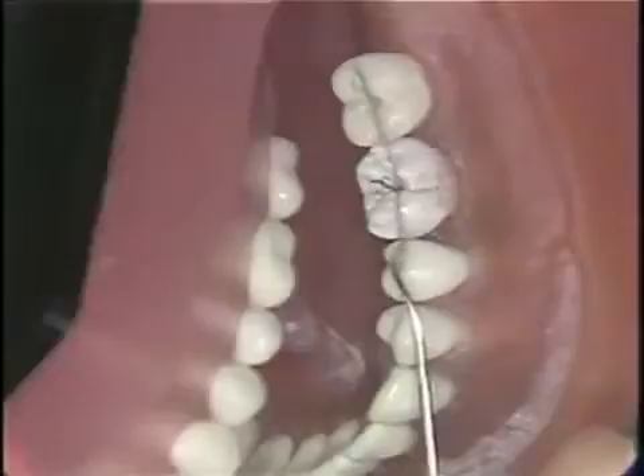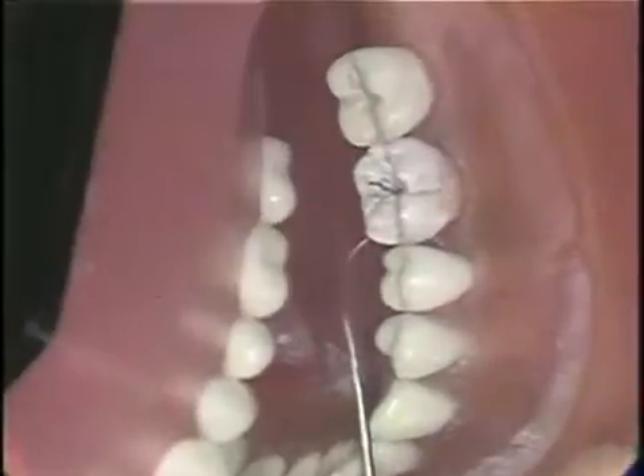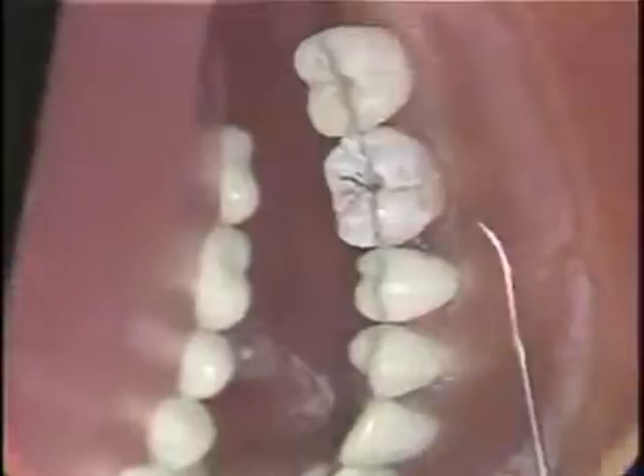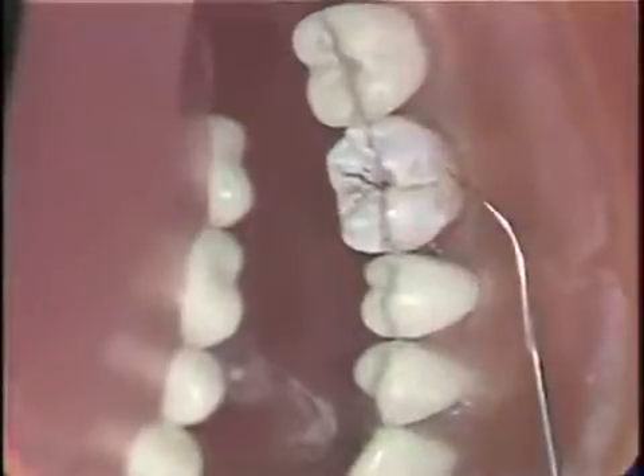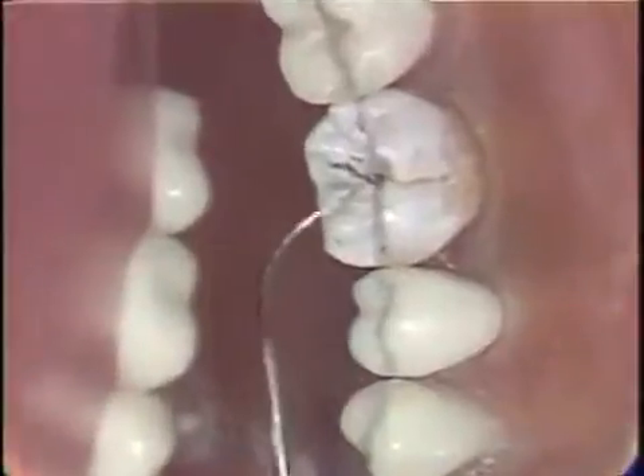Amalgam core restorations are used on teeth greatly weakened by caries or previous restorations. The technique consists of placing pins into the remaining solid tooth tissue, providing pulpal protection and replacing the lost tooth tissue with amalgam.